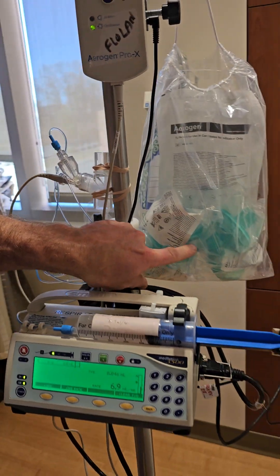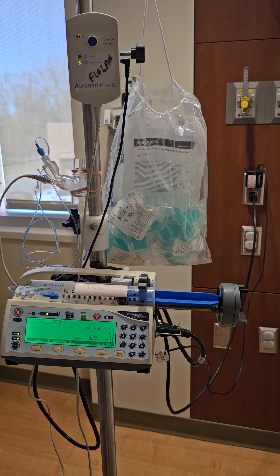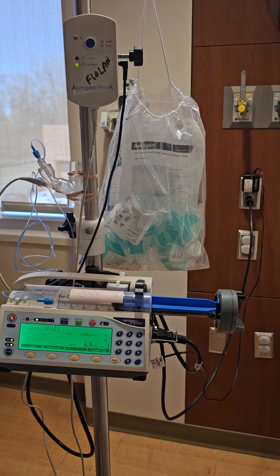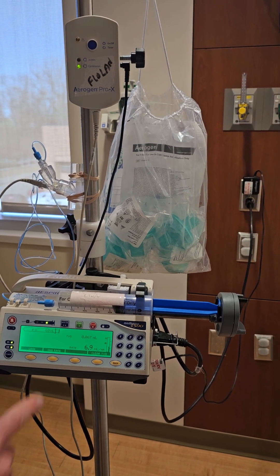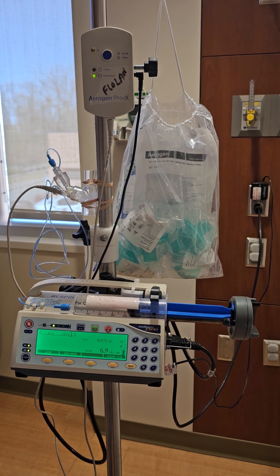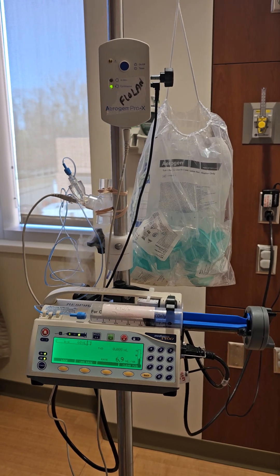Lastly, the filters in this bag — these green filters — we want to add those to the proprietary filter port of the ventilator on the outside, and change those every time we change the Flolan syringe to keep the sticky medication from gumming up the internals of the ventilator. And that's it.